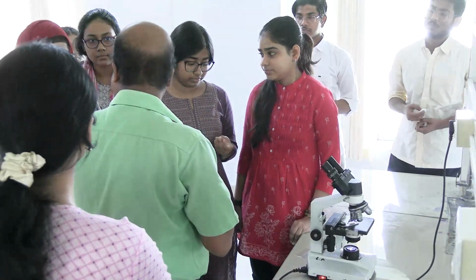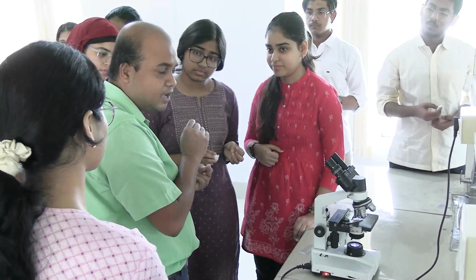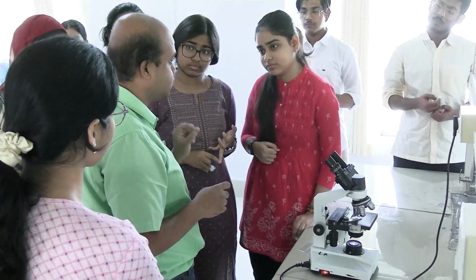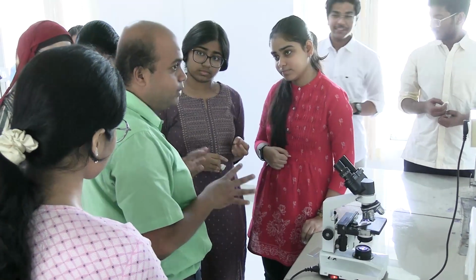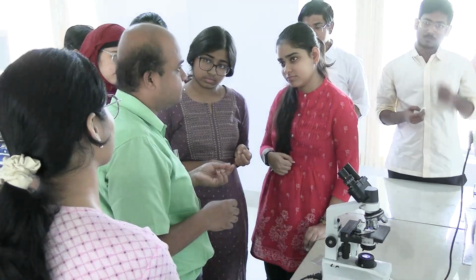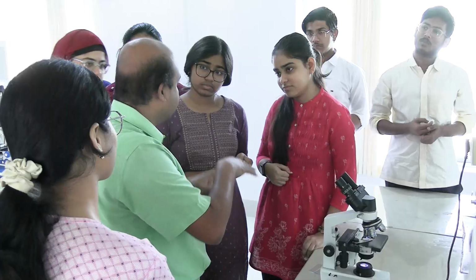People who were there on Saturday have already done it, I think, but many are new, so there should be a single deep prick so that the blood flows out freely. If you have not done it earlier, you will be anxious, and if the prick is not deep, then it is our automatic reflex that you will try to squeeze out blood. What happens then? Tissue fluid. We'll read about tissue fluids in general physiology.